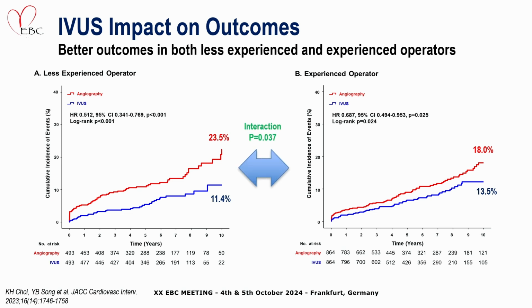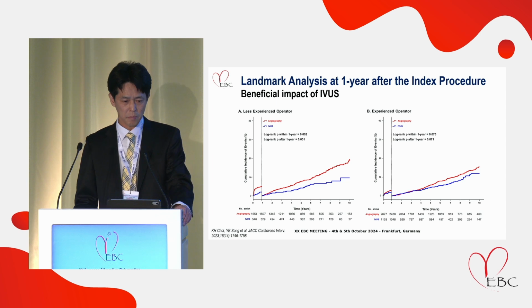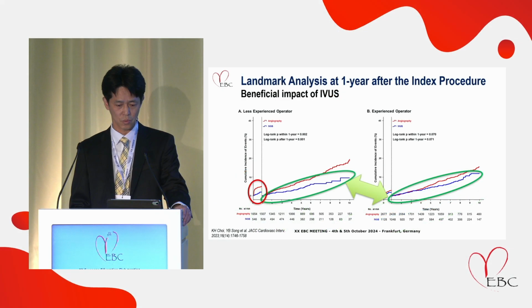Interestingly, there was a significant interaction, indicating that IVUS guidance provided greater benefit for less experienced operators. The beneficial impact of IVUS was most prominent within the first year post-PCI, only in less experienced operators. However, as you can see here, the continued benefit was observed over the long-term follow-up period. Importantly, patients treated by less experienced operators using IVUS guidance had comparable outcomes to those treated by experienced operators using IVUS guidance.